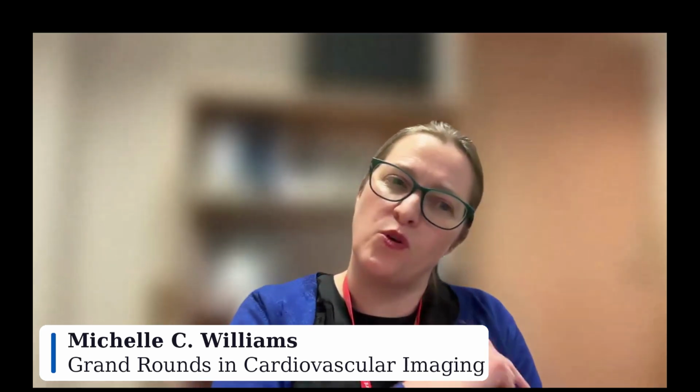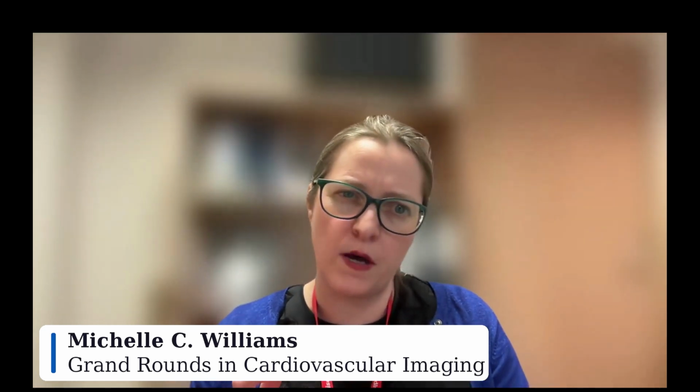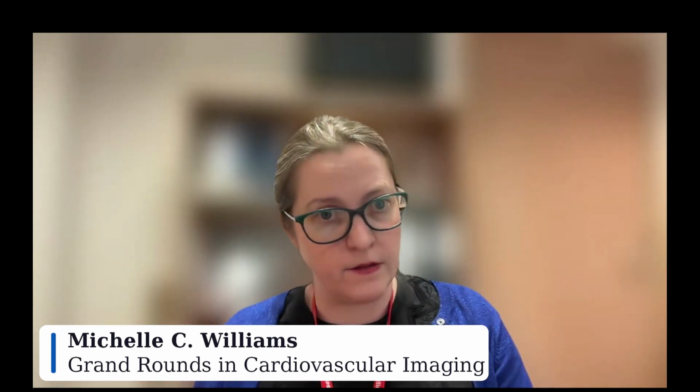So that's why non-calcified plaque burden is actually a good one to use in drug trials compared to total plaque burden, because the non-calcified plaque being that higher risk plaque and being the earlier plaque that we want to stabilize is an important one to use. So that's why non-calcified plaque might be slightly better than total plaque for the drug trial comparisons. Okay, thank you. Excellent.